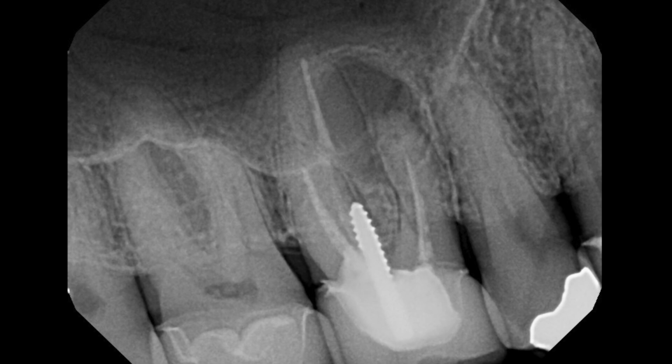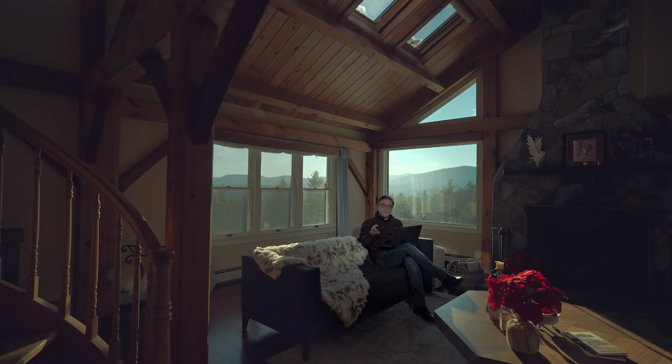Now, some people prefer to do calcium hydroxide in these cases, but the technique that I'm going to show you now will hopefully show you how you can actually do the revision in a single visit if you're adding a surgical component to it at the same time, by curetting out the lesion and then proceeding to making sure that you have a retrofill.